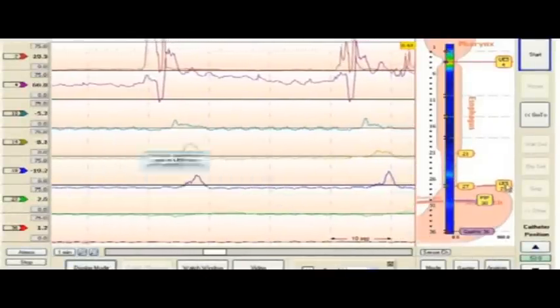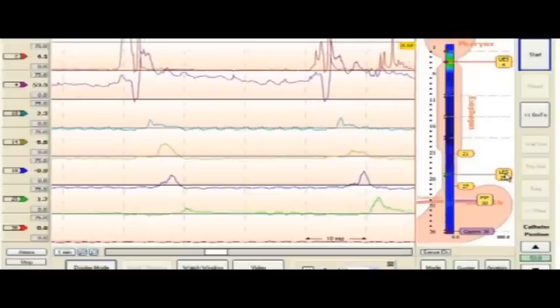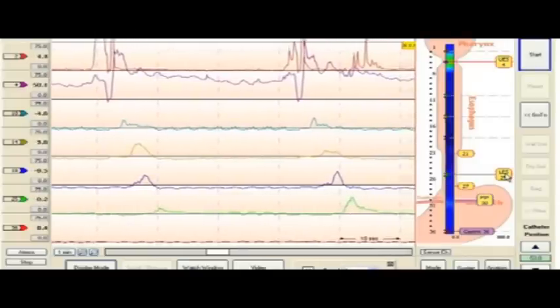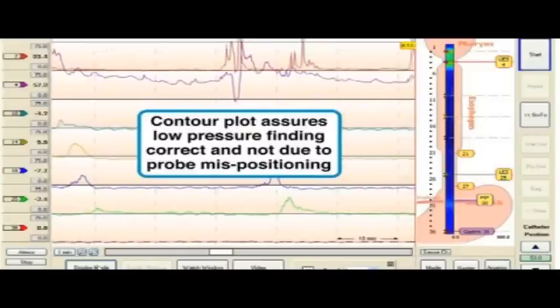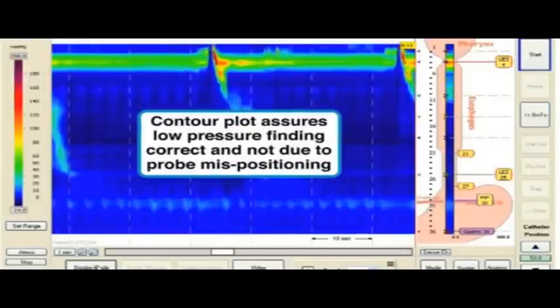The high-resolution display confirms that this is indeed an extremely hypotensive sphincter abnormality, rather than a case of an incorrectly positioned catheter, a situation that cannot be resolved from data collected with conventional devices.